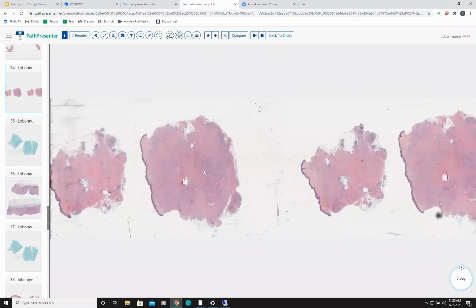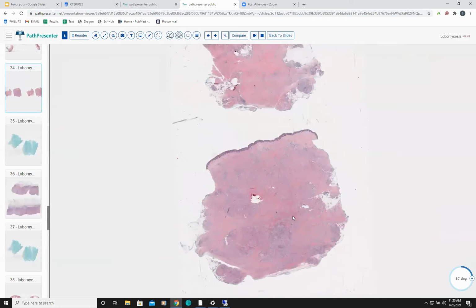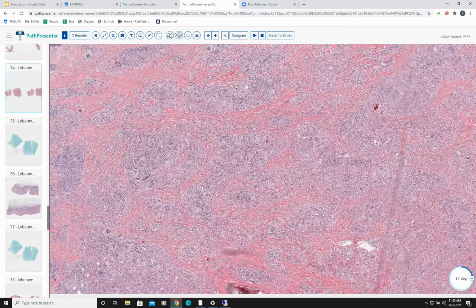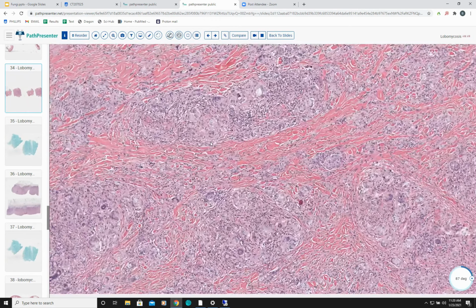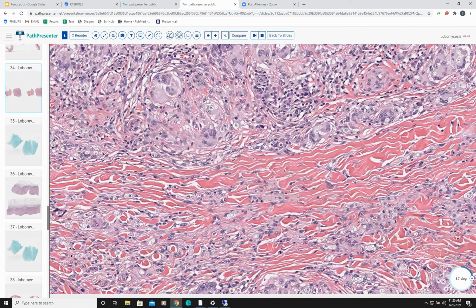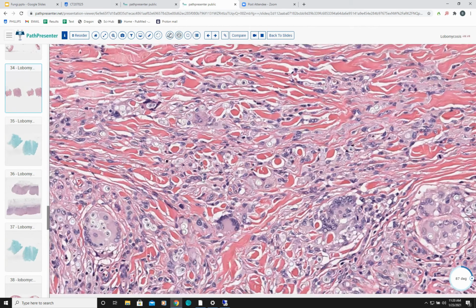The next is lobomycosis. So this one, you see epidermal atrophy in contrast to the pseudoepitheliomatous hyperplasia that you see in the others. And these present with keloid-like lesions. And remember here, foamy histiocytes are characteristic. And also you don't see the organisms in H&E because they don't stain. They're just negative space. I think these are the organisms, and again, you see many organisms with these. Yeah, it's clear space.